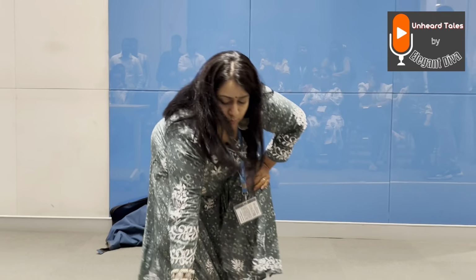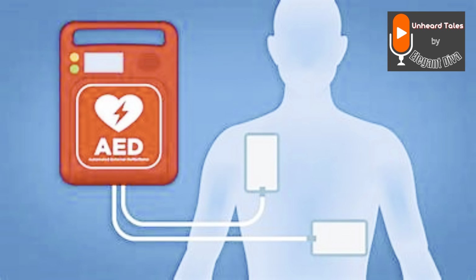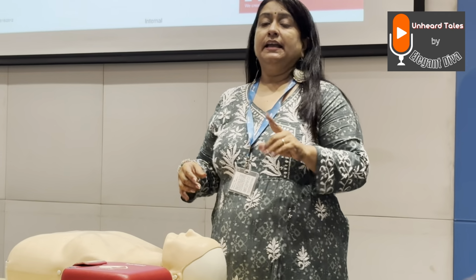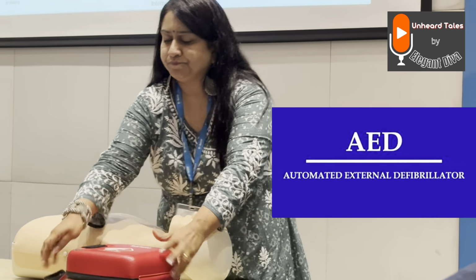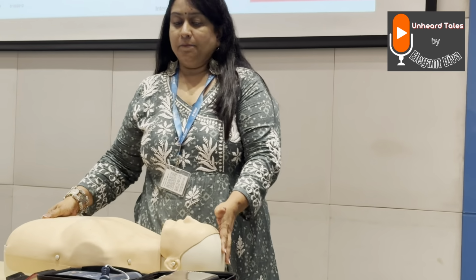Okay, now after this, I just wanted to show you this is an automated external defibrillator. It's a very useful device to have. So you must have seen in hospitals, in Bollywood movies, the doctor taking paddles and shocking the patient. So this is to deliver shock. But this device is autonomous, no breathing or anything is needed. The first thing, if you can use it, is use an AED, even before you start CPR. Okay, so how do you use an AED? I cannot use it because I cannot deliver shock here, but I'm just showing it to you.